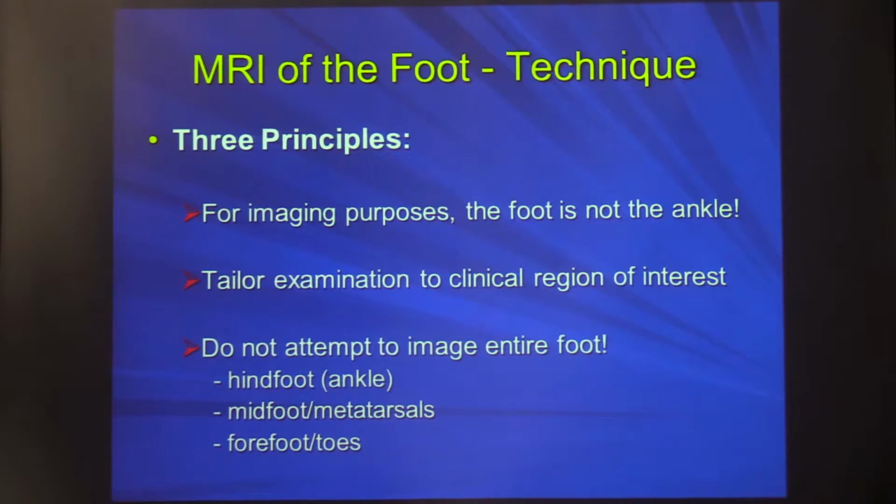So if we focus on MRI of the foot, there are three basic principles. For imaging purposes, the foot is not the ankle. The second point is that imaging should be tailored to the region of interest, and do not in any way attempt to image the entire foot on MRI at one time. Either image the ankle, which includes the hind foot, the midfoot metatarsals, say for stress injury, or the forefoot toes for plantar plate, turf toe, or Morton's neuroma.